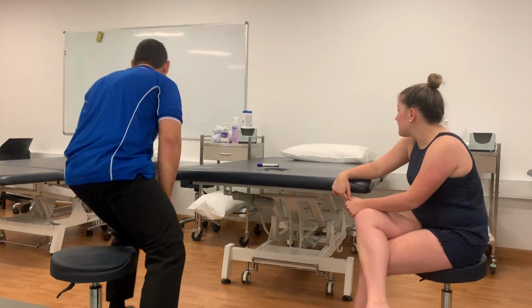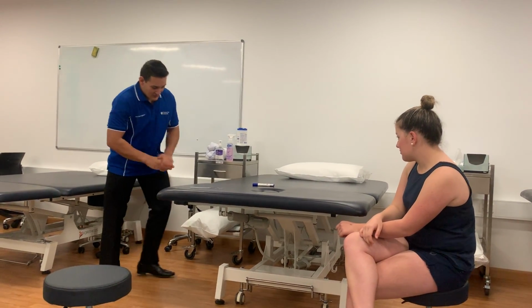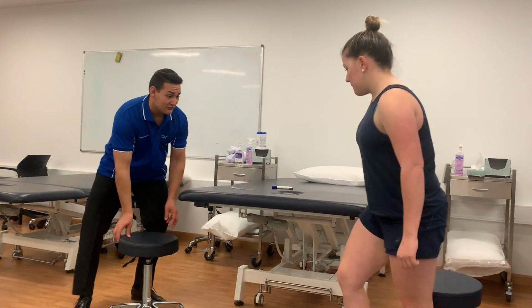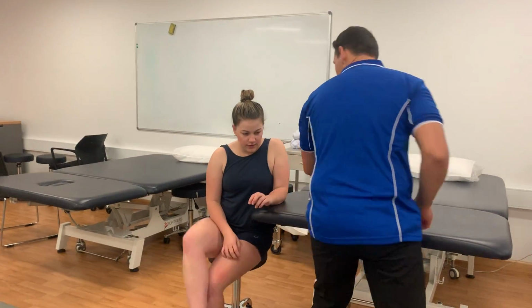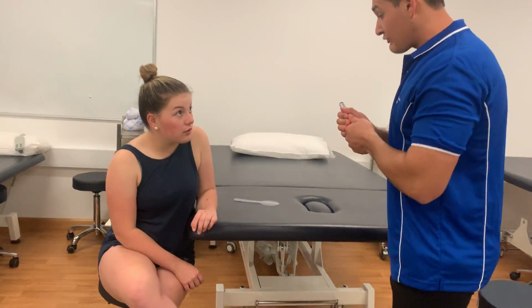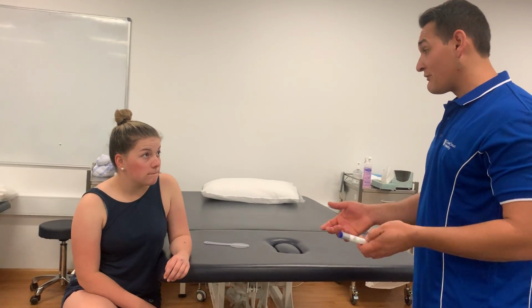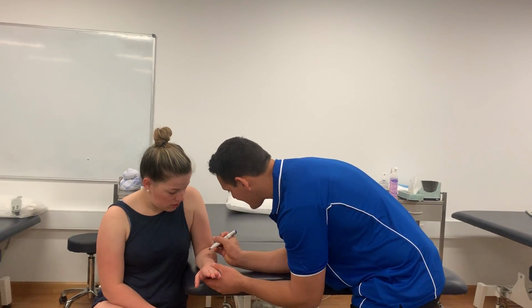You do. Okay, wonderful. So I'm just going to wash my hands and do the bed brakes first. Alrighty, beautiful. Check the bed brakes. Yep, bed looking stable. Okay, Simone, if I could just get you to come over and sit on this side, we're going to do your left hand side first. Okay, just like that, and we're going to be moving in like this. I'm going to mark some points on your arm, Simone, because that will give me a more accurate measurement and a better reading of what's going on in your wrist. So I'm going to mark up here, just down here, and just down here.